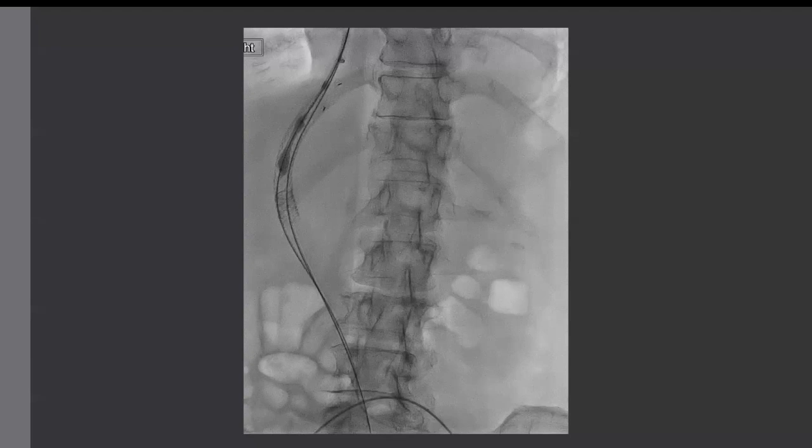One is the old TIPS, one is the new TIPS stent, or endograft, and one is that balloon expandable stent. And two of those three are inside of the prior TIPS that's too big. And then you can just measure the pressures and adjust how much the balloon is inflated and thus how small the new TIPS stent is. Does that make sense?